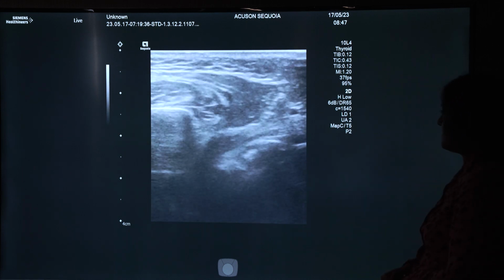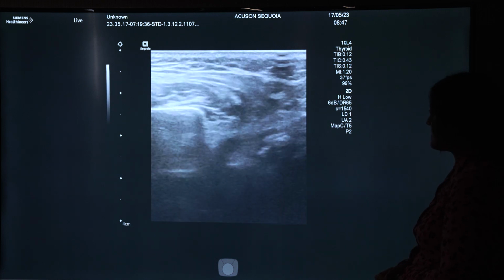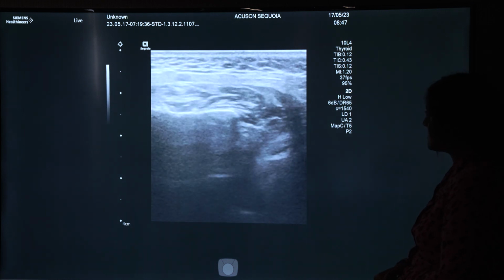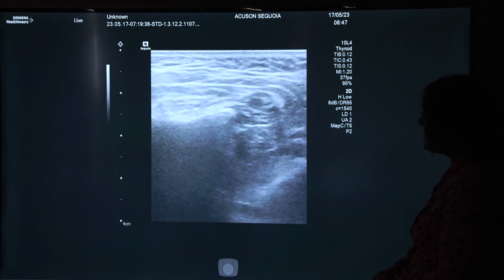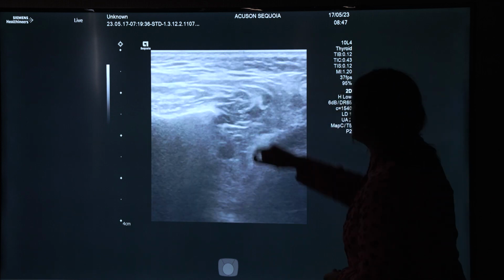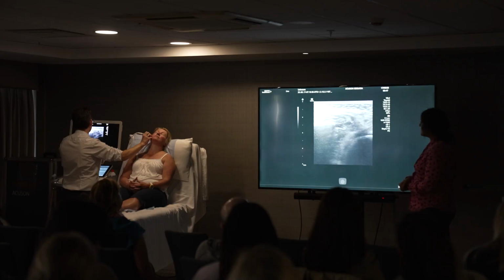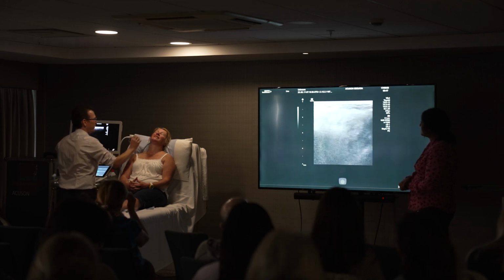Yeah. So you just be looking along this course, either for accessory parotid tissue overlying the masseter muscle, which is just there, and also looking for the duct as well. Because Susie's normal, we won't do anything to worry about.